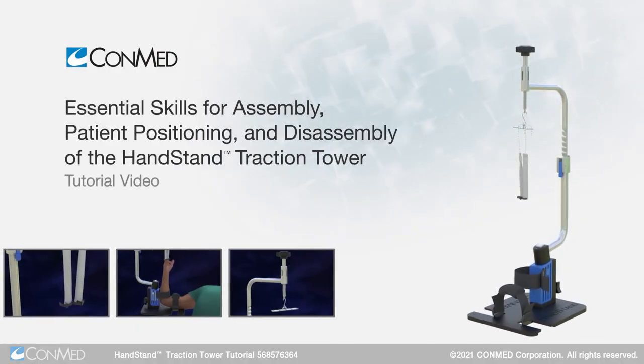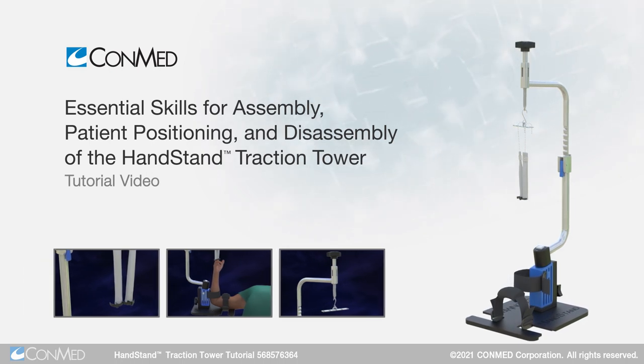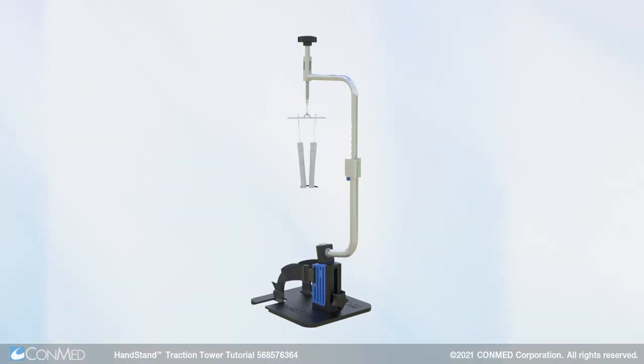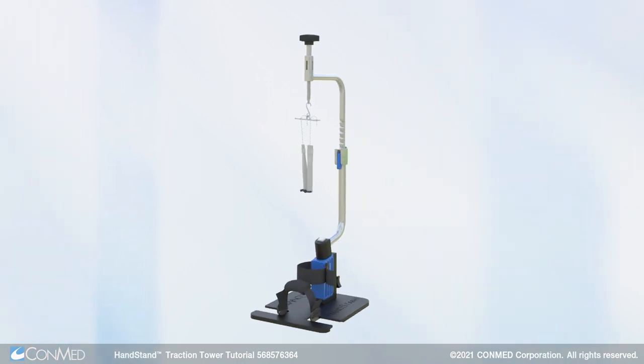The handstand traction tower is designed to be used in conjunction with either an armboard or hand table. Prior to positioning the patient, all pads must be removed from the armboard or hand table.